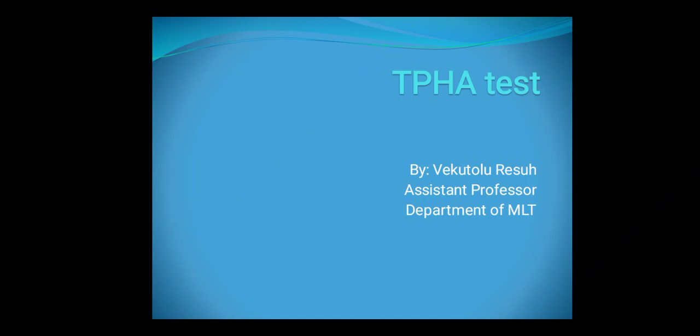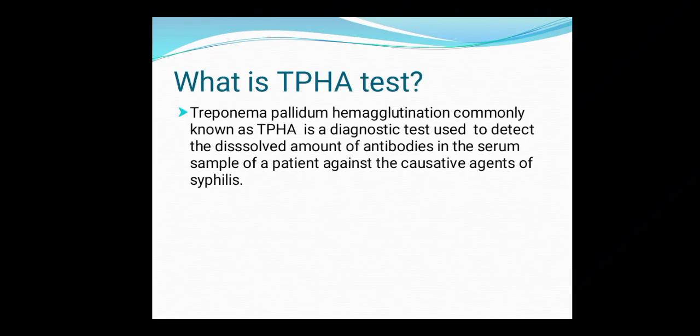Today I'll be explaining the TPHA test. So what is this TPHA test? Treponema pallidum hemagglutination, commonly known as TPHA, is a diagnostic test used to detect the dissolved amount of antibodies in the serum sample of a patient against the causative agent of syphilis.